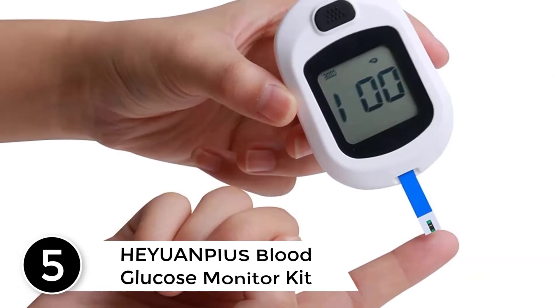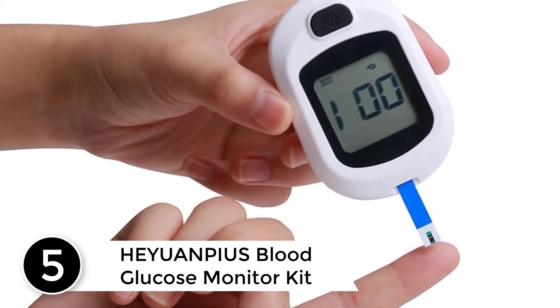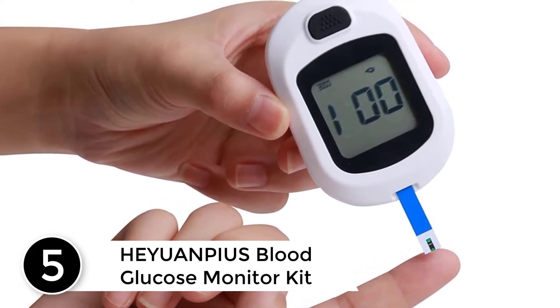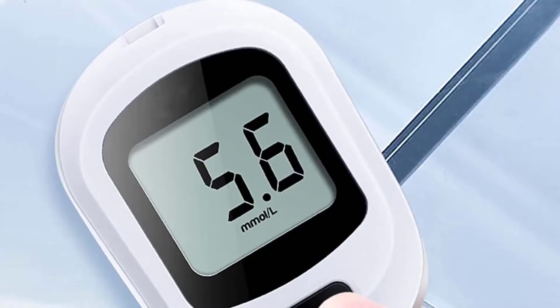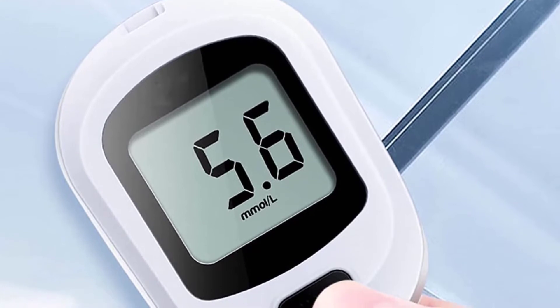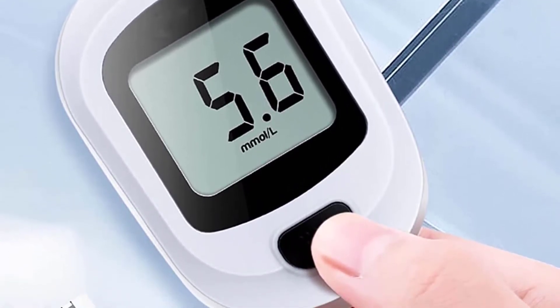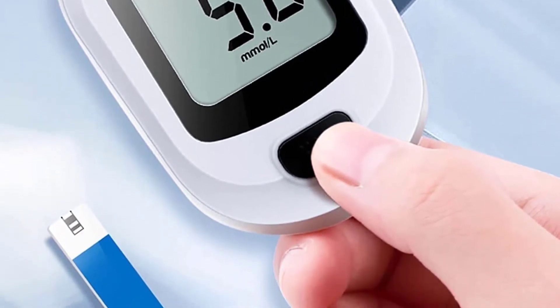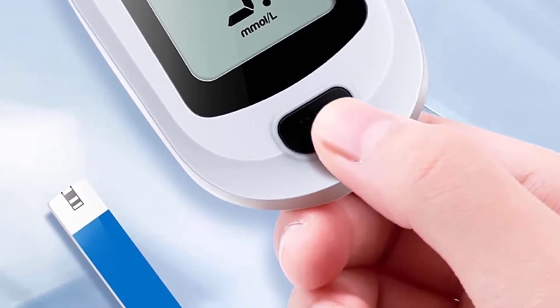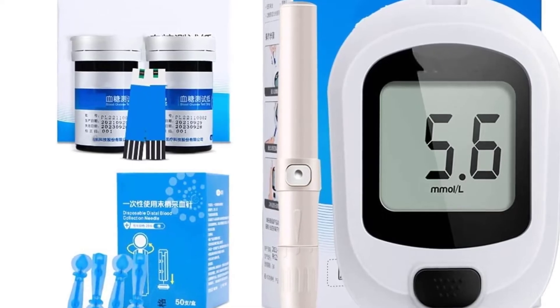Starting at number 5: HEYUANPIUS Blood Glucose Monitor Kit. 4-Electrode technology adds points for precision, and technology upgrades are only for more accurate sugar measurement. Single-key design is simple and easy to use — short press to view the memory value without extra keys. Lightweight and portable, the weight of the blood glucose monitor is only 26 grams for monitoring anytime and anywhere.